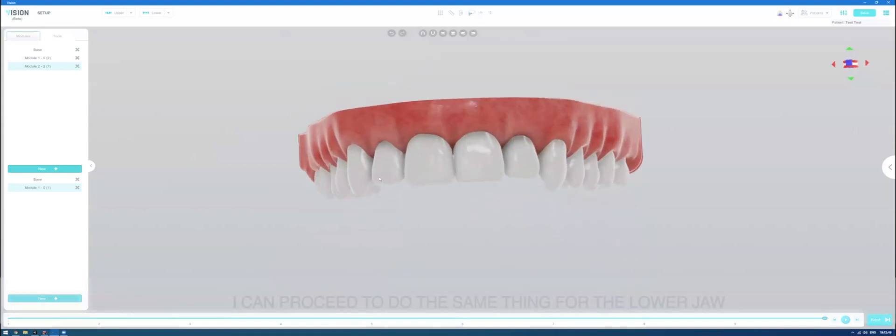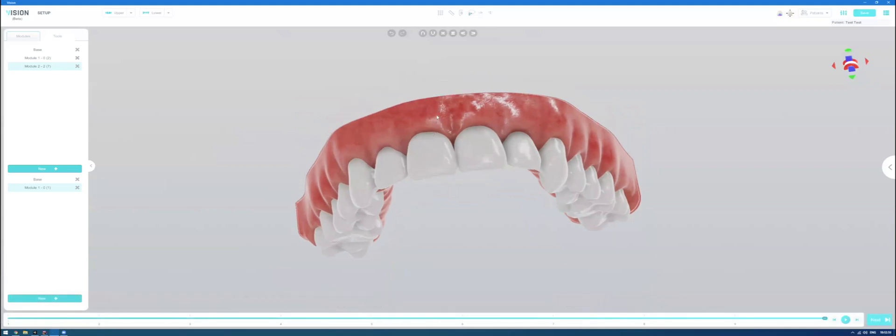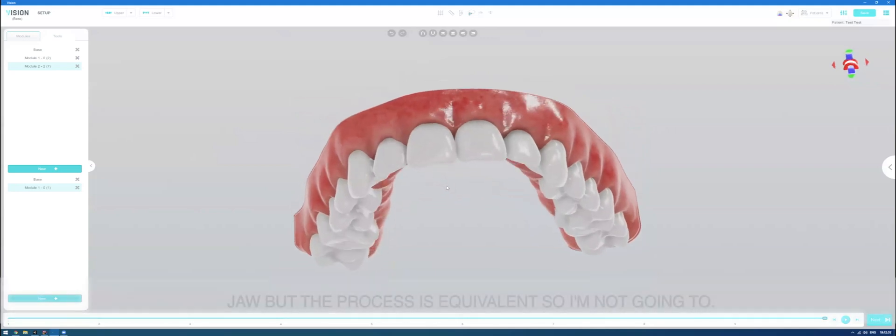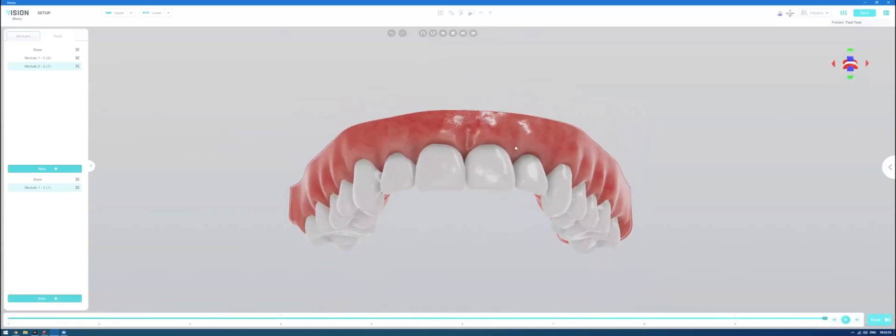I can proceed to do the same thing for the lower jaw, but the process is equivalent, so I'm not going to.